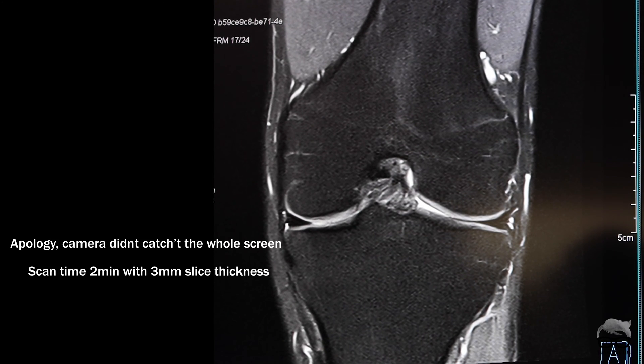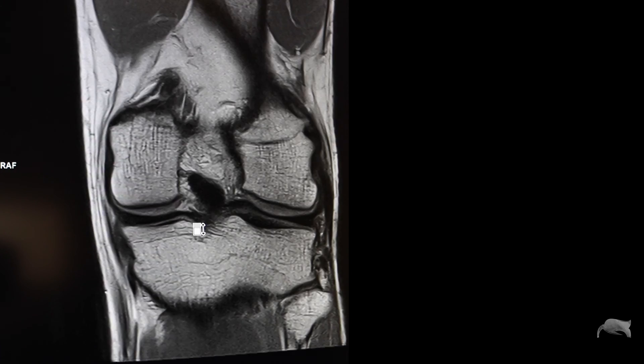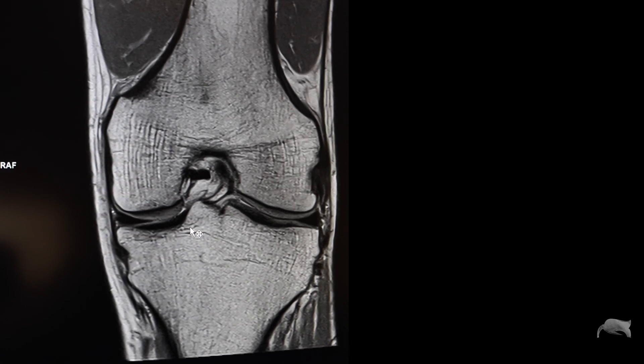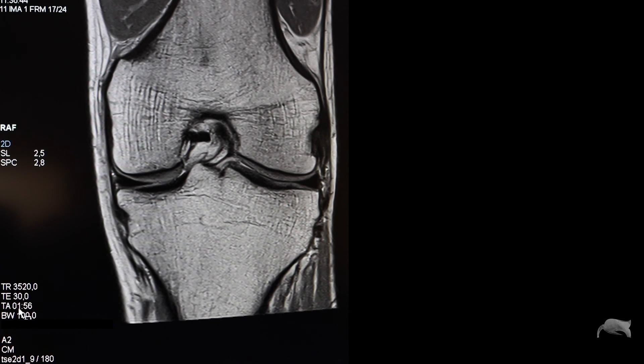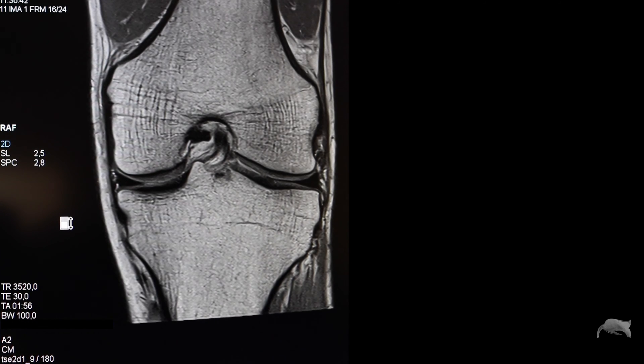It actually took around two minutes — three millimeter slice thickness, 30 slices. No way! And how long do you think this one took? I'm going to have to go shorter now, so I'll say three and a half minutes. It's a PD without FATSAT — also two minutes, with a two and a half millimeter slice thickness. These are decent images for that amount of time on a lower Tesla, aren't they?